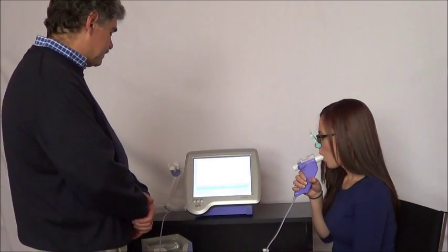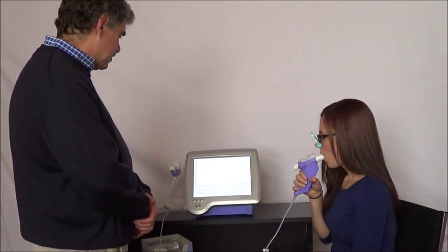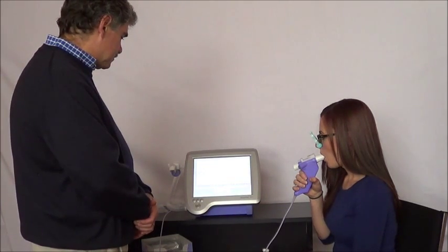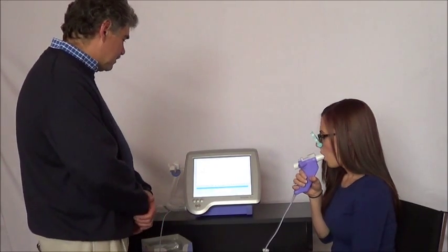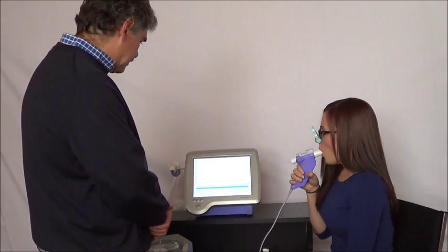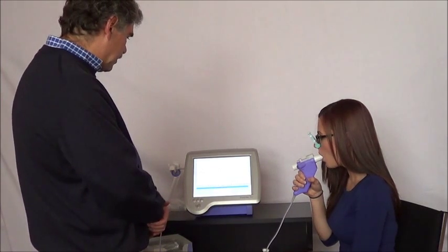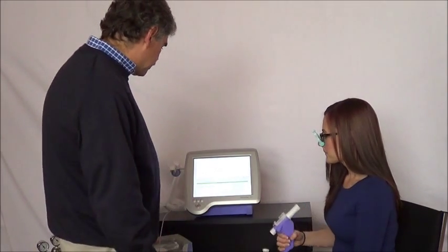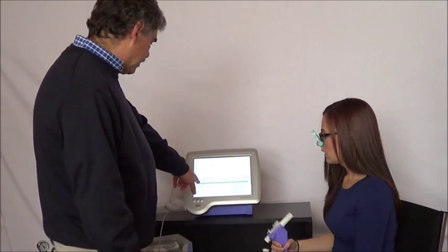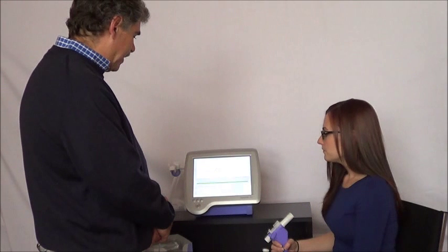Go ahead and breathe normally. Nice and relaxed. Now fill your lungs completely — fill, fill, fill — and exhale. Full exhale, keep going, keep going, keep going, keep going, keep going. Great. Session complete, great job. We got a grade of A with 10 milliliters of reproducibility. That's an excellent slow vital capacity.